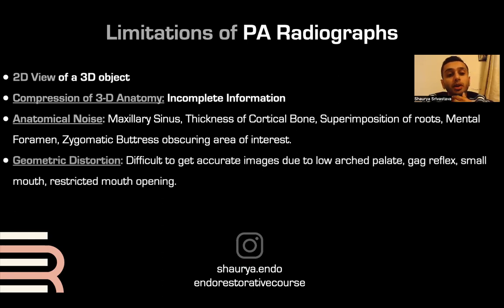Okay. Geometric distortion. You may find it difficult to get accurate images with low arch space, because patients can have different arch lengths. A gag reflex, we're going to talk about that, where there was an improvisation in a case that I did when a patient was kind of rejecting taking a radiograph. Small mouths, restricted mouth opening. These can all be difficult, and this is where CBCT comes in useful.